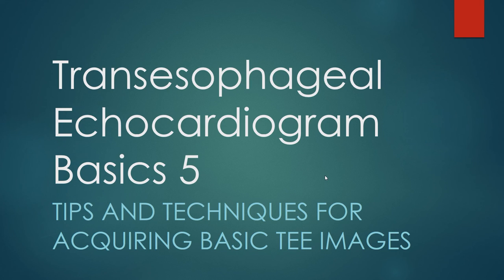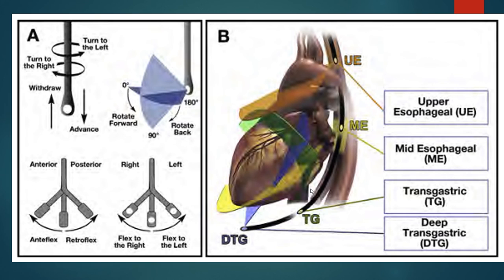Talk in the Transesophageal Echocardiogram series. This is probably the most important talk for fellows, and this is tips and techniques for acquiring basic TE images. So this is often the most difficult to learn because you need your hands on the probe.